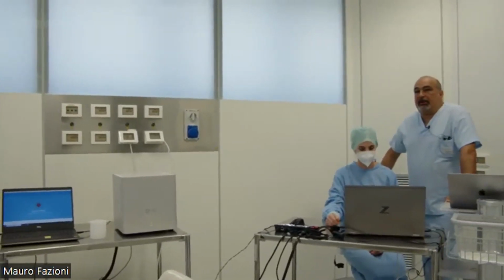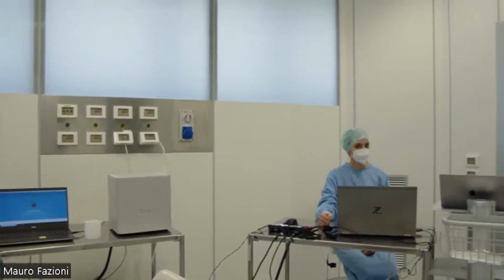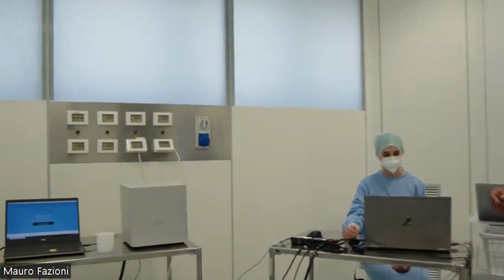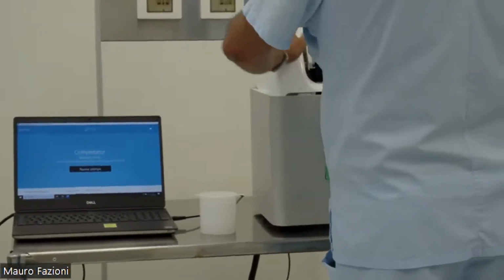It is a post-curing, okay? And it's very important to cure after 3D printing because it will improve mechanical properties, okay?